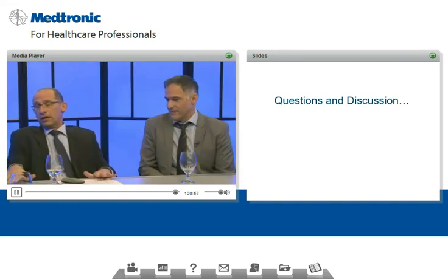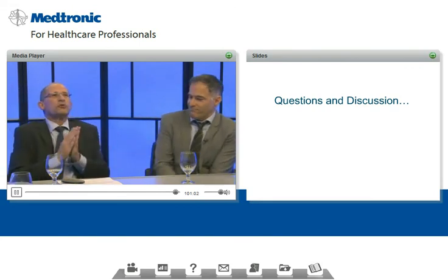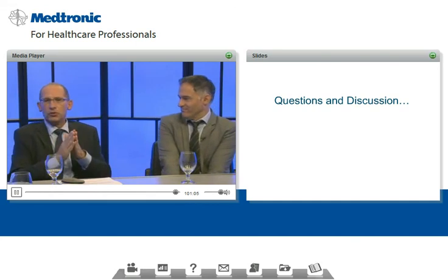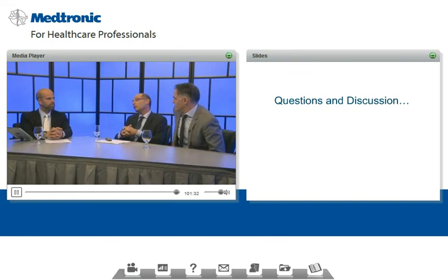Now, it's a difficult answer. It's an easy question and a difficult answer. It's very hard to quantify this in a very systematic way. So what we usually do is look at the average boluses, because we know that the bigger the bolus, the longer the activity of that specific bolus is. So if somebody is using 2 to 4 units as their average bolus, it's going to be short, 3 hours, 2 hours. If somebody's using 10 to 12 units, it'll be 4 to 5 hours. So we're looking at what the average bolus is to define the active insulin. But I don't think there is a right way to do this. But I would love to hear your input.